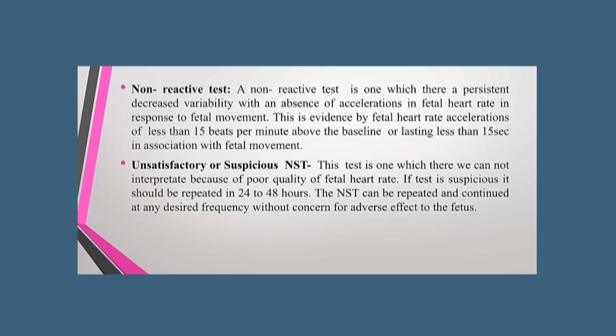In an unsatisfactory or suspicious NST, we cannot interpret the test because of poor quality of the fetal heart rate. If the test is suspicious, it should be repeated in 24 to 48 hours. The NST can be repeated and continued at any desired frequency without concern for adverse effects on the fetus.